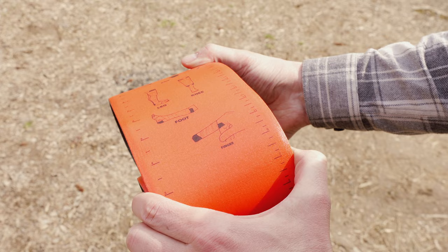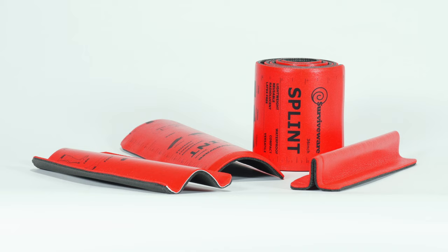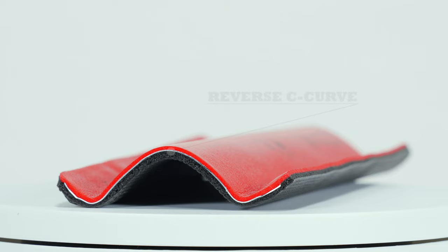The splint gets its strength from the cylindrical folds used during application, so practice these thoroughly: the C-Curve, the reversed C-Curve, and the T-Curve for maximum strength.